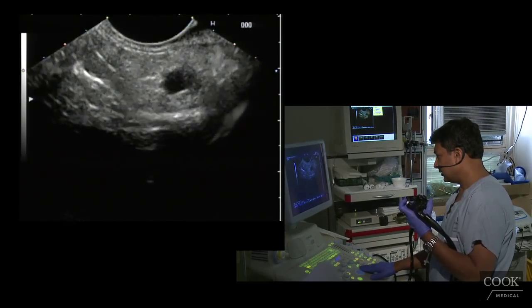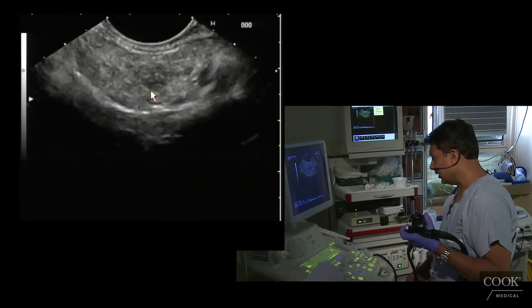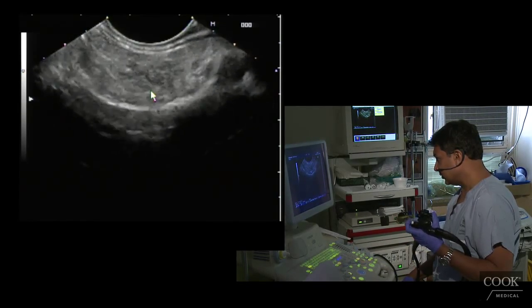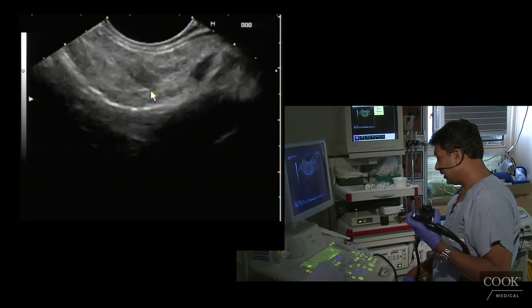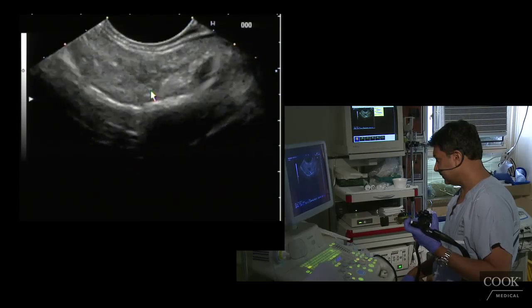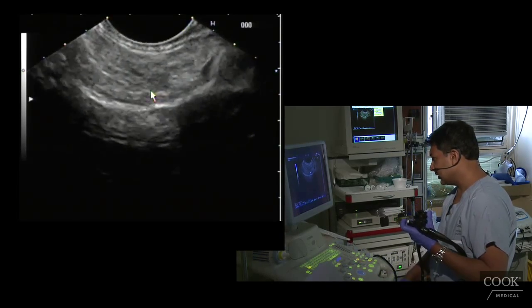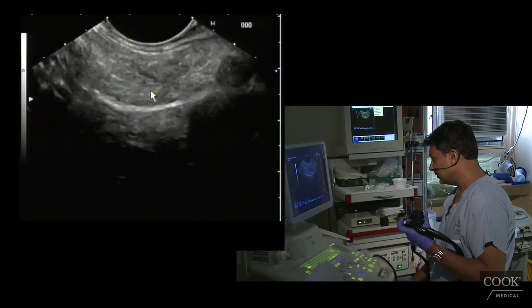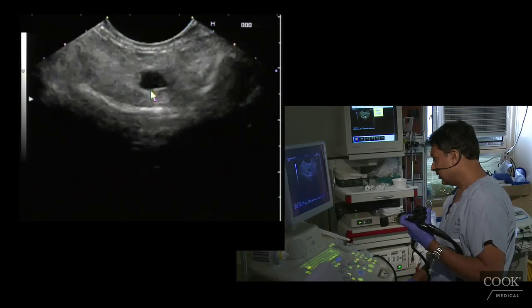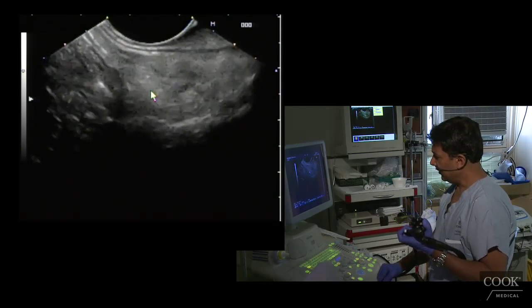And then you wonder if there's something. And sometimes if there's a stone, it can be very subtle. It can be really hard to see. If I found a stone, I would be much more reassured. But I'm not seeing it. Because are we just going to keep doing EUSs on this guy for the rest of his life? I think it's certainly worth a discussion with the surgeon to see what the long-term plan is for this guy. Okay, and that's it.